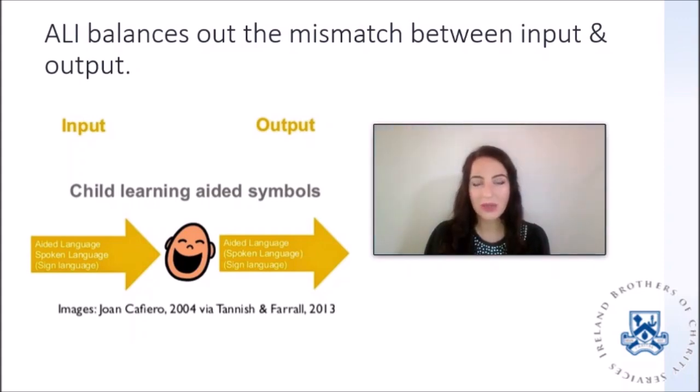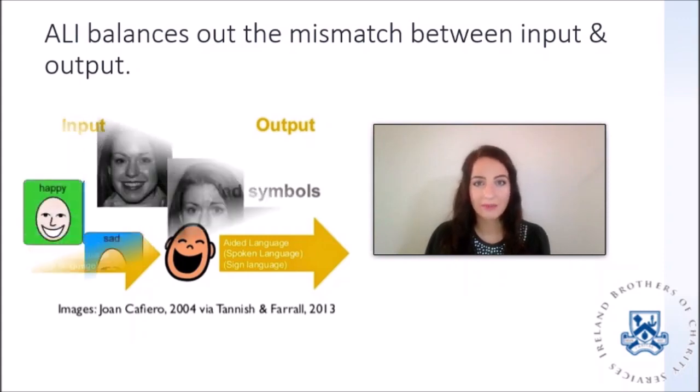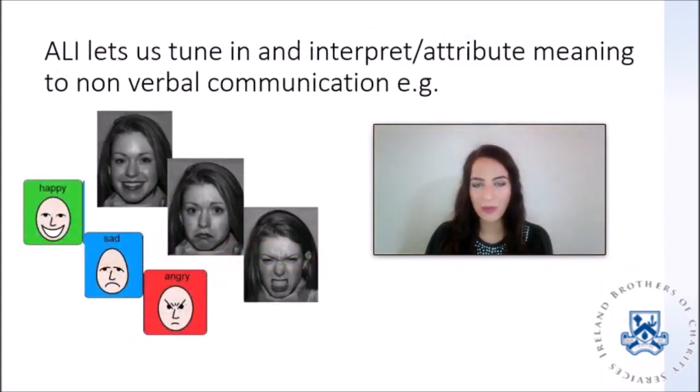Some of these users don't get to spend much time with others who use AAC at all, so it's even more important for communication partners to model either on the language learner's system or on a separate, similar system to the language learner. And in time, a communication partner can ask the language learner if they're comfortable with them modeling on their system.